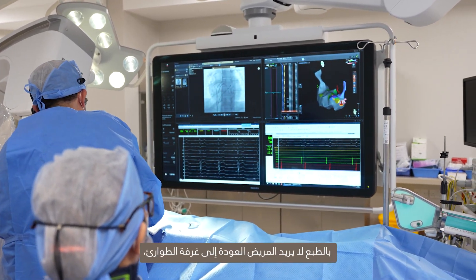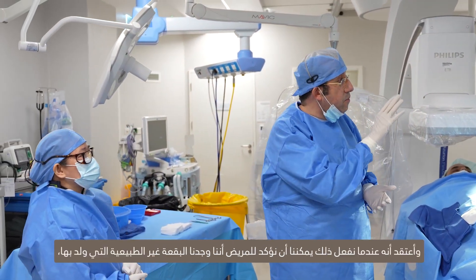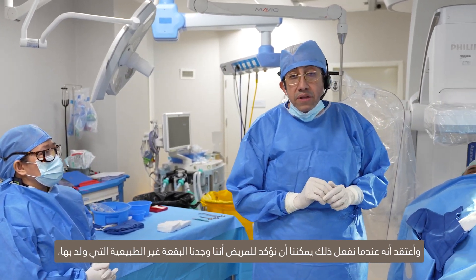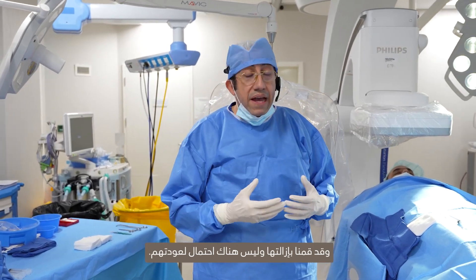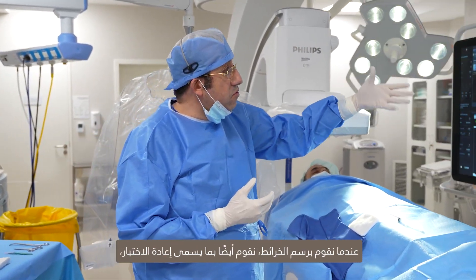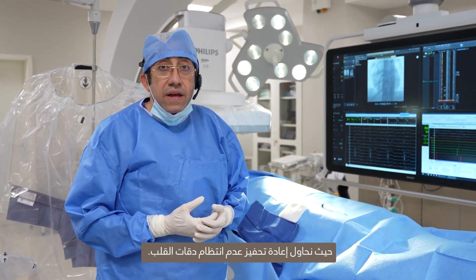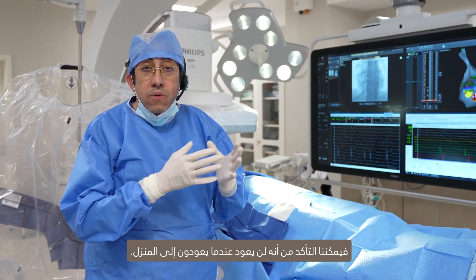The patient does not want to have to come back to the emergency room, they don't want to take medication for the rest of their life. When we do the procedure, we can assure the patient that we have found the abnormal spot they are born with, we have eliminated it, and there is no likelihood of them coming back. At the end of the procedure, we also do what's called retesting — we try to re-stimulate the tachycardia. And if it's gone, we can be assured it's not going to come back when they go home.